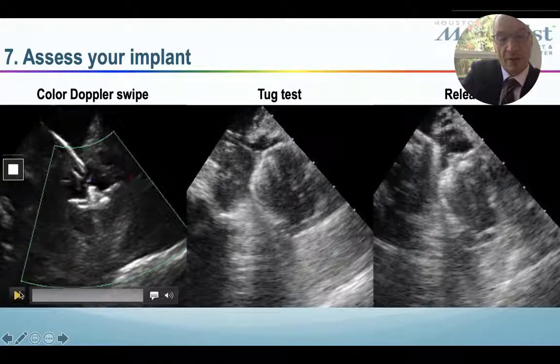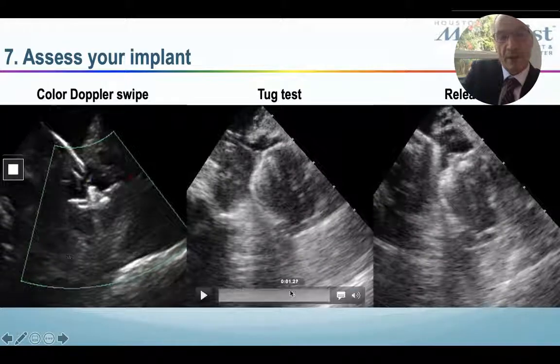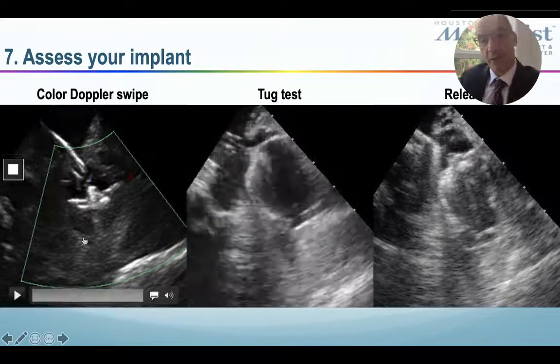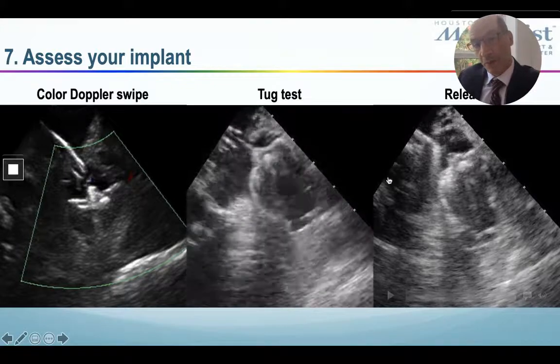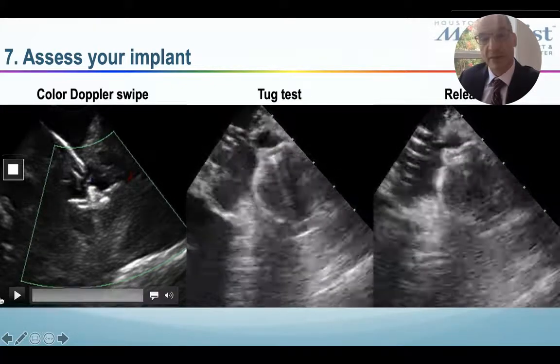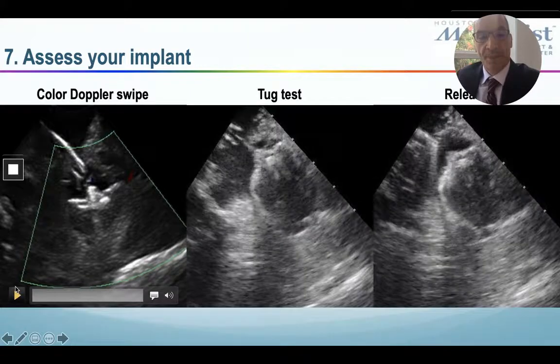This is one example where we go from frontward to backward. Well, it doesn't want to play. And then here we are using the tug test to see that the Watchman is engaged, and then we release the Watchman and we let it go, and it stays.